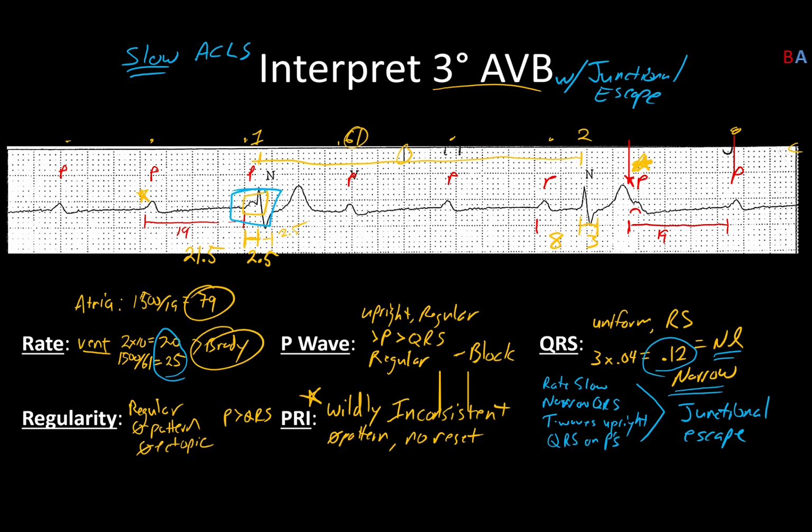So I do want to take just a little bit of time to tell you about this patient. I actually had one that was exactly like this. She came in, she was in junctional escape, and this was her heart rate for the entire night. We sat there for all 12 hours until she could get her permanent pacemaker put in the next morning.